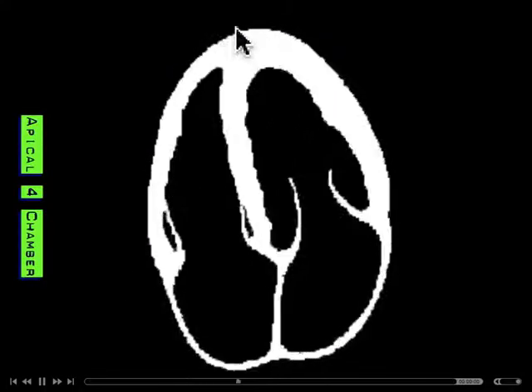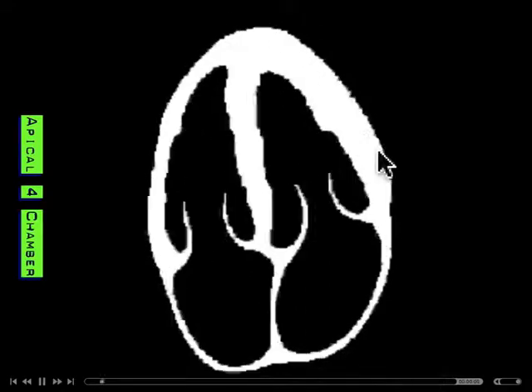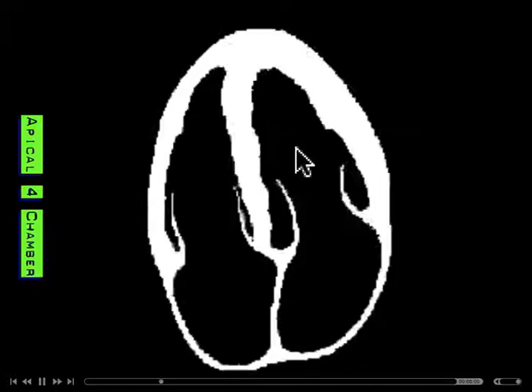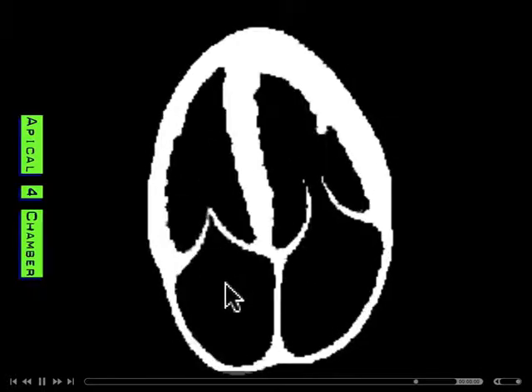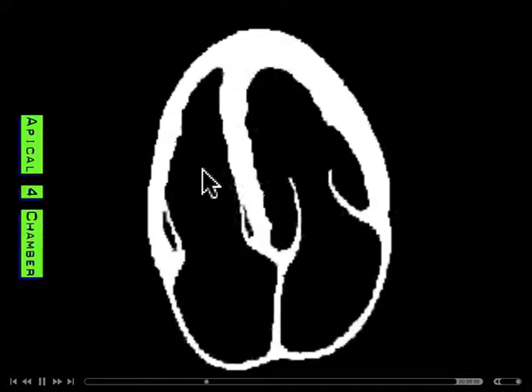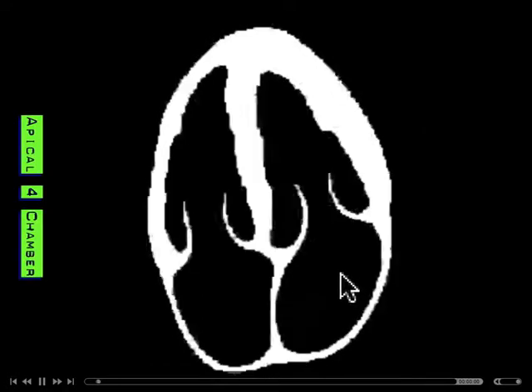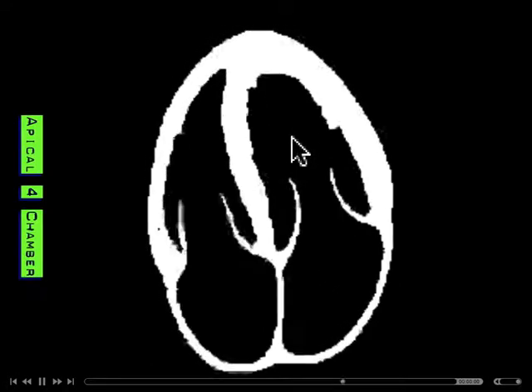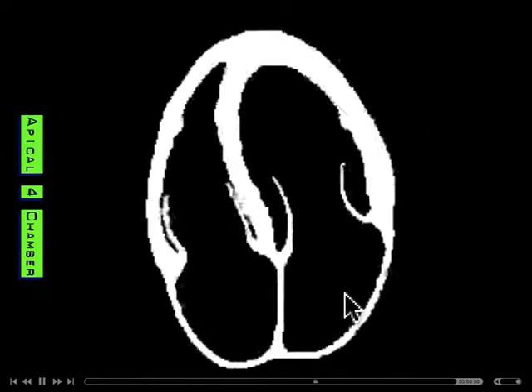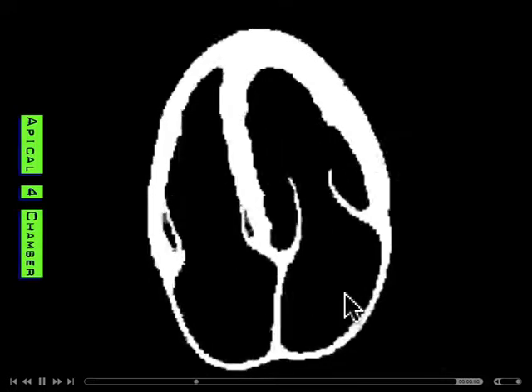And this is a schematic of that apical four-chamber view. Just think about our probe being right up here, and that sector of sound is coming out like this, apex of the heart being here. And if we were to put color here, here's the left atrium, here's the left ventricle, right atrium. Remember the indicator is to the patient's right, which makes this the right side of the heart. Left atrium, the blood is flowing from the left atrium into the left ventricle. And if we were to put that color flow signal along here, well, red would be flowing towards the probe, and blue would be flowing away from the probe. That's the idea. So keep that in mind as we go through this stuff.